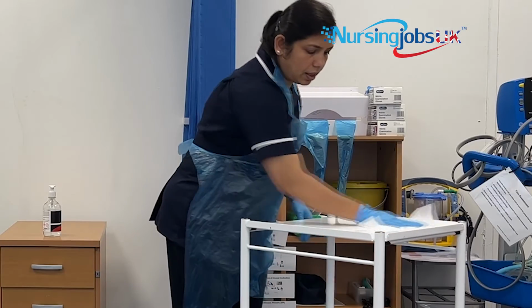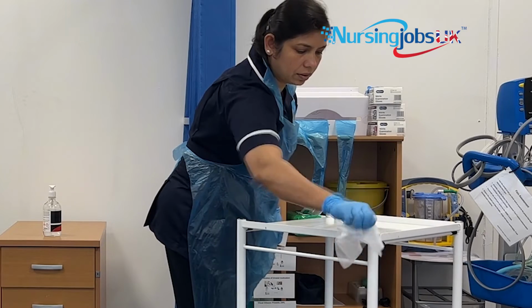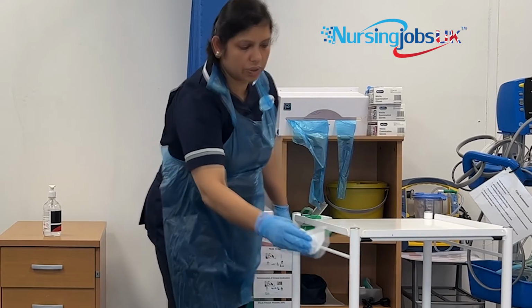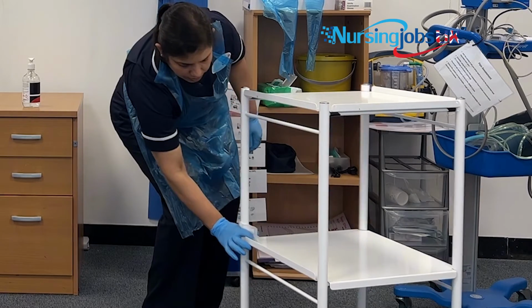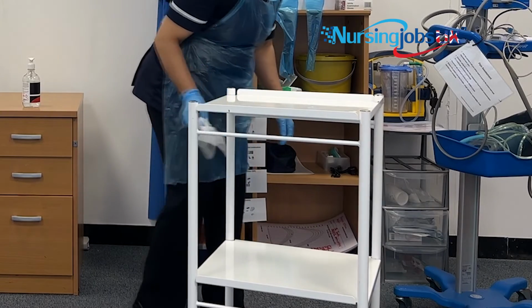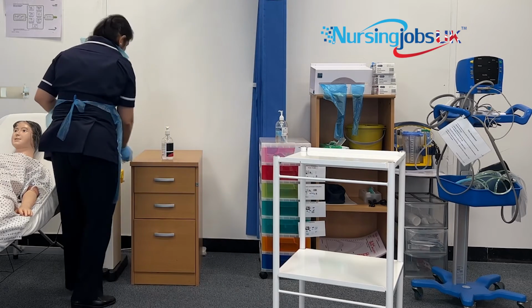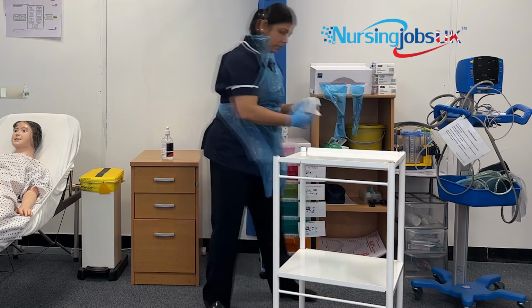Do the cleaning in a zigzag motion, from the farthest to the nearest. Now move like this, then again the farthest, then nearest. Once you're done there, move like this, then farthest, then nearest. Then you just need to discard that one in the clinical waste. Take a new one.